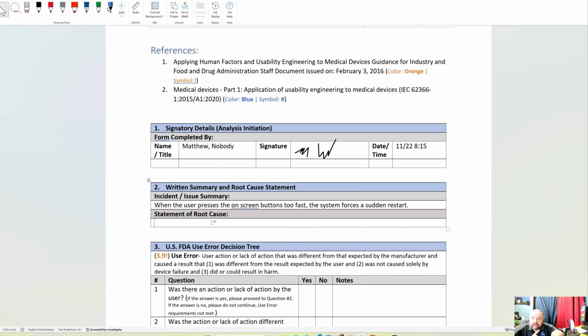Now, there could be a lot of reasons for this to happen. And in order to determine a full root cause, we'd have to be filling out other paperwork. And to find a formal statement of a root cause, we might be doing a 5 why analysis. But for right now, we're just going to call this inconclusive, because I don't know why this is happening. This could be a mismatch between performance specifications and user needs. It could be a whole bunch of things.